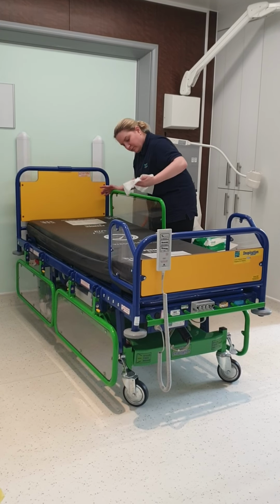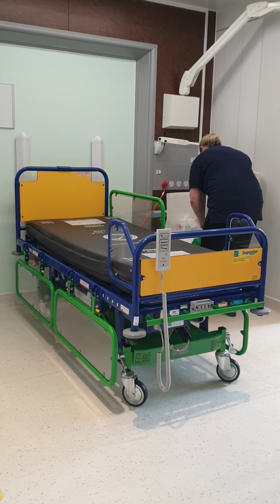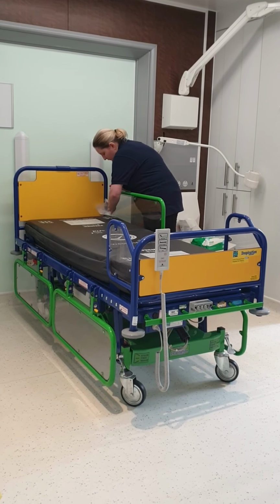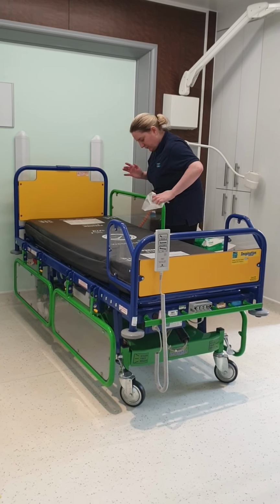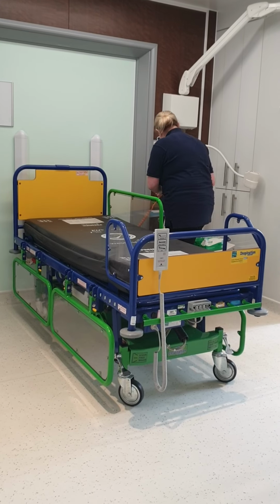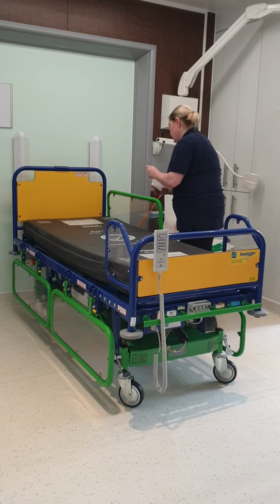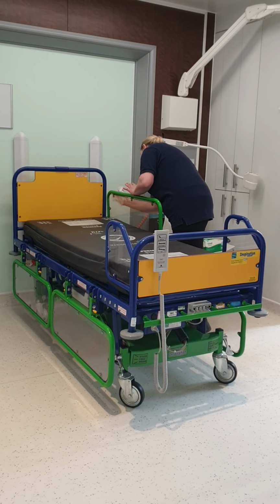You can see here again, we're using an S-shaped motion on the side. For those surfaces like the rail itself that are not amenable to an S-shaped clean, we are cleaning along it in one long motion, not going backwards where we've already cleaned.